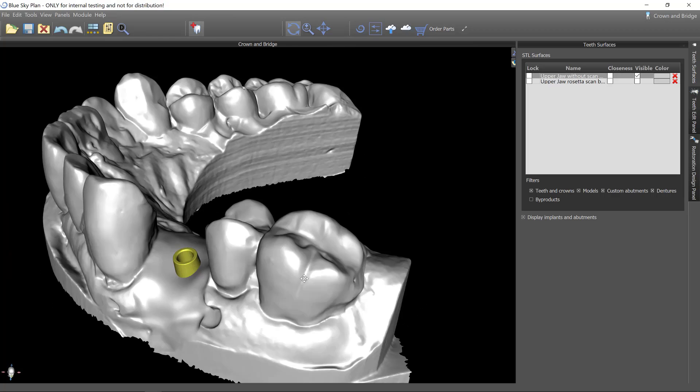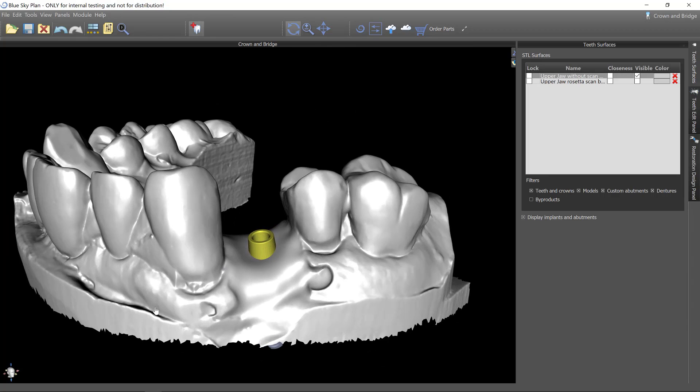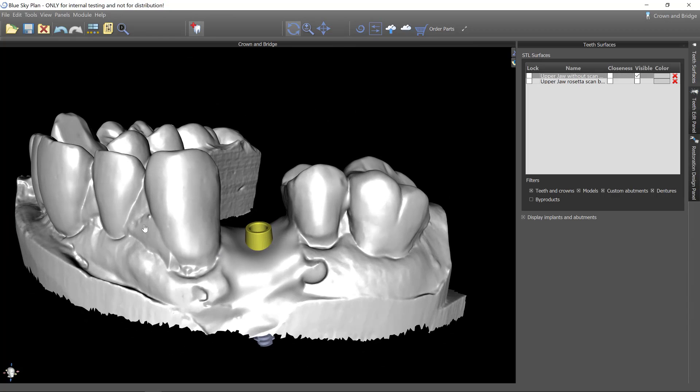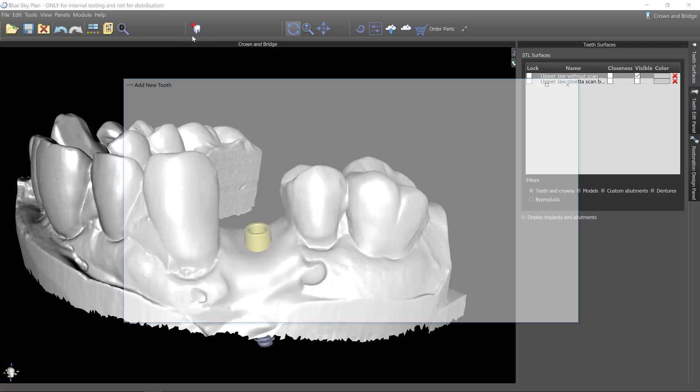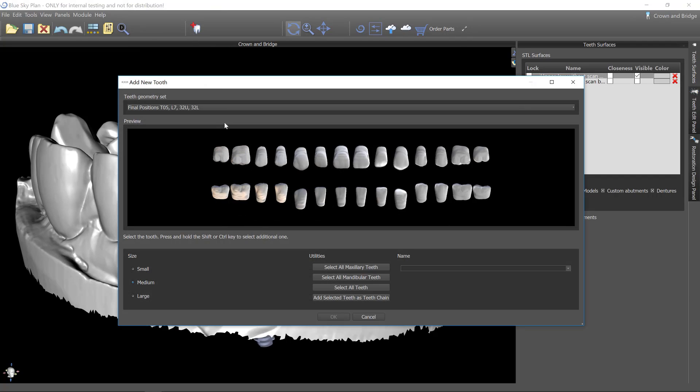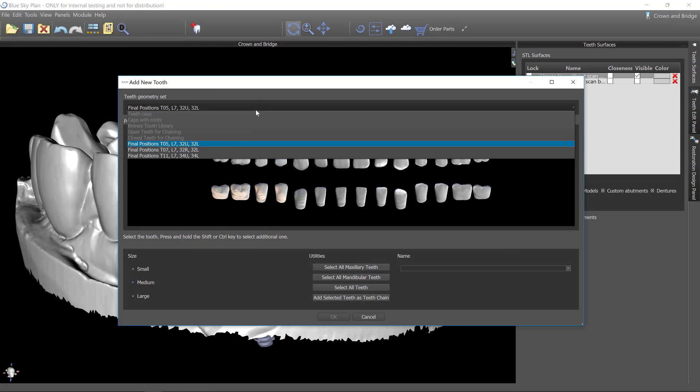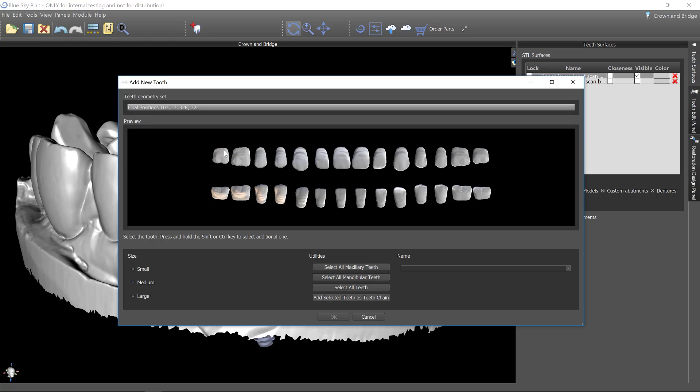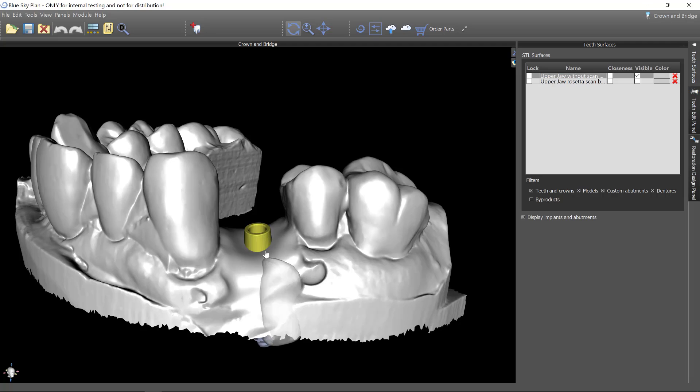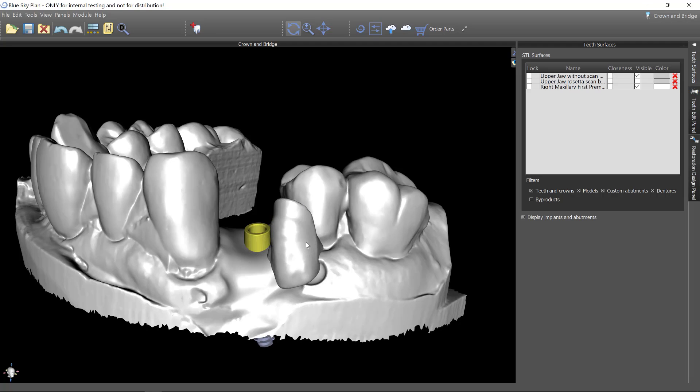So the first thing I want to do is to add a tooth. Right now the only libraries that are in here are the nobilium denture teeth. So once again this is early alpha. We don't have all the tooth libraries. So let's just use a denture tooth and it will work just fine. I'm going to click OK and shift and drop this into the case.